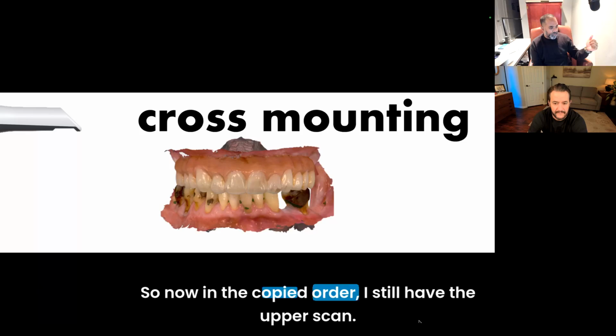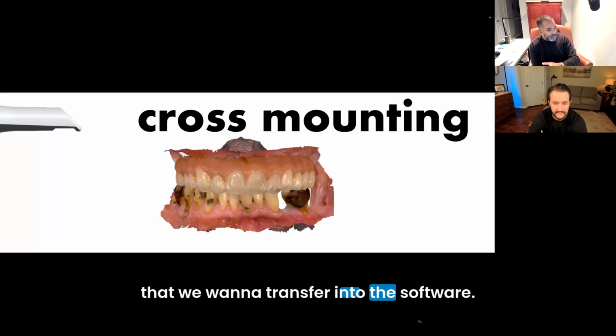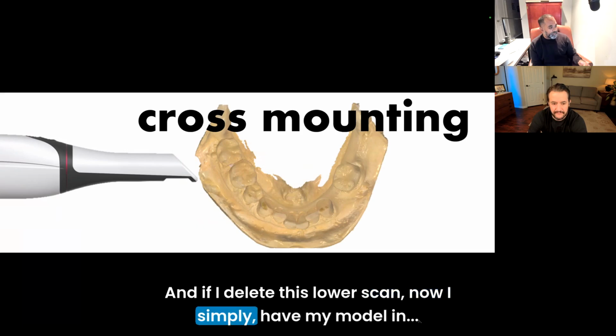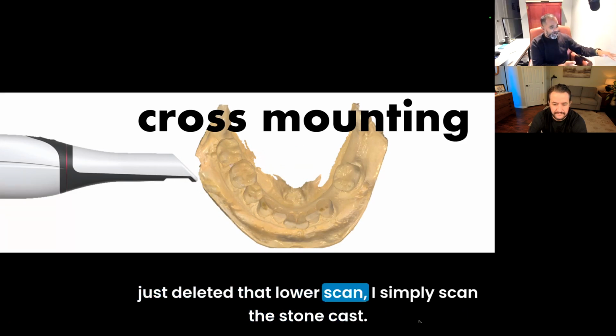So now in the copied order, I still have the upper scan. I have the bite on the left, the bite on the right, the bite relationships that we know that we want to transfer into the software. And if I delete this lower scan, now I have my model in the office. I'm going to use my intraoral scanner, and in the scanning window where I just deleted that lower scan, I simply scan the stone cast.